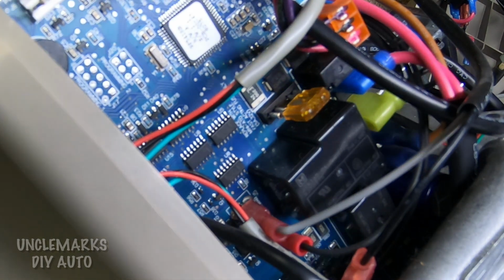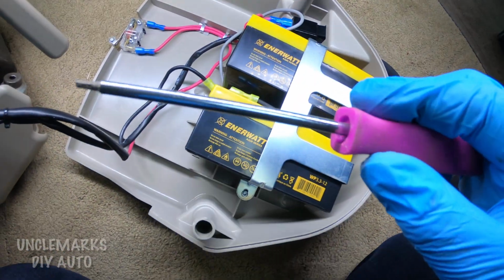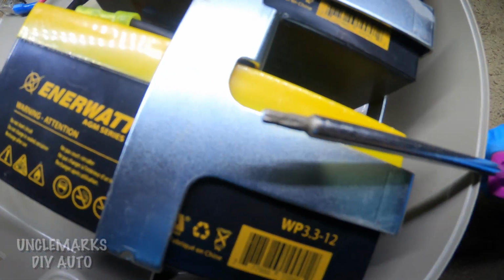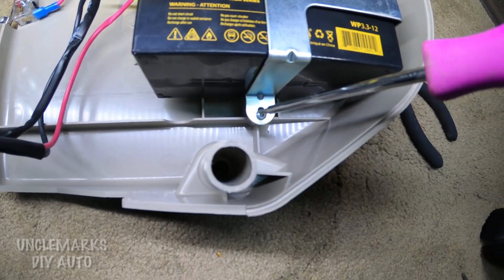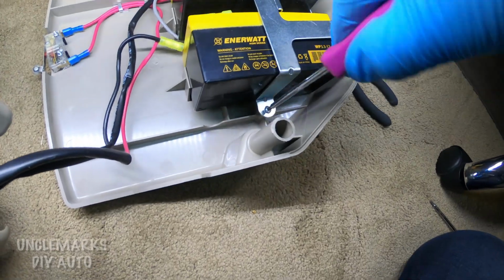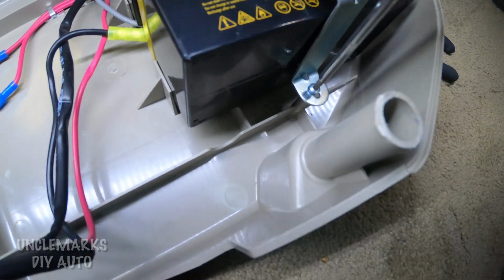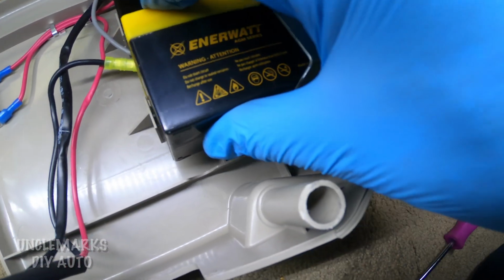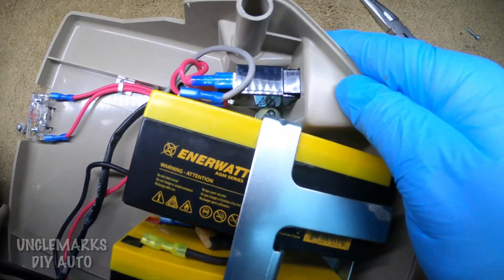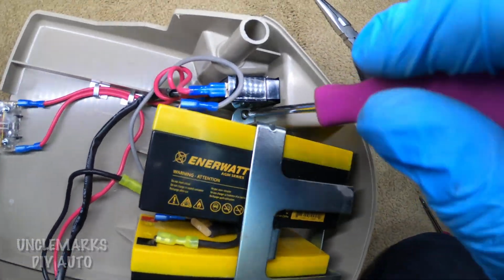Well, let's continue now. Oh, give her a push with my finger. There we go. How about battery replacement? So on the side of this one looks like it takes a torx bit. It's good to have some of these screwdrivers around. Get this one out. Of course, they have to make it just a little bit harder, so maybe it's something you normally don't have with you. But we'll take these out anyway. It's just this hold down's got a couple screws holding it in there. I got the one side off. Might be able to just slide the batteries out and get this other one out here too. I don't know if the switch is in the way or not. No, I think I can do it.